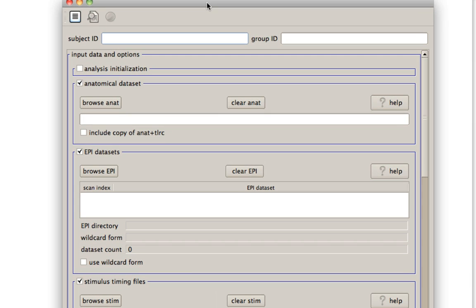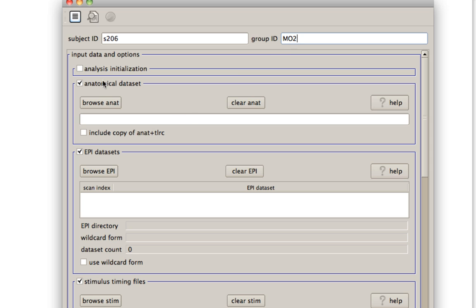Within here, you can see there are options for all the different steps of preprocessing that you'd want to do with a typical fMRI dataset. First off, let's give it a subject ID. Notice that it needs to start with a letter. You can't just start it with a number or else it'll give you an error message. For the group ID, I'm going to call this MO2.